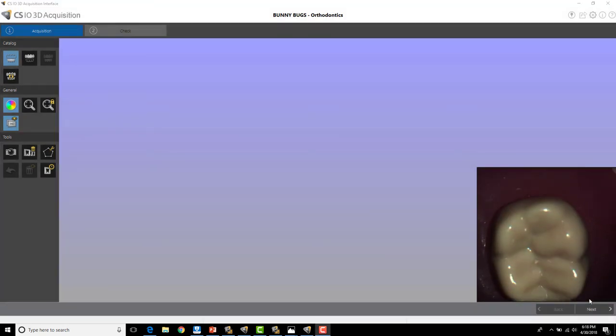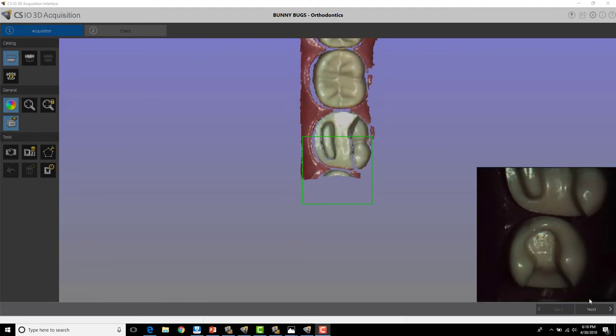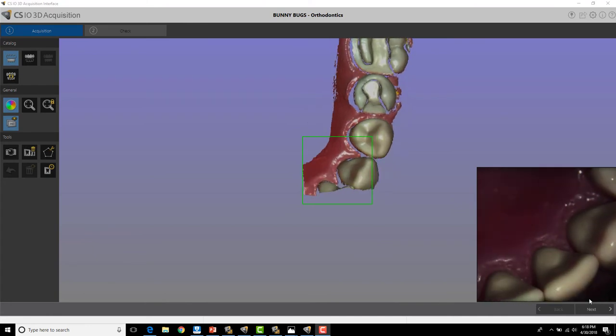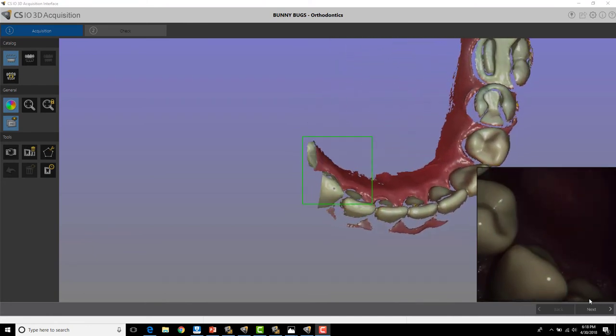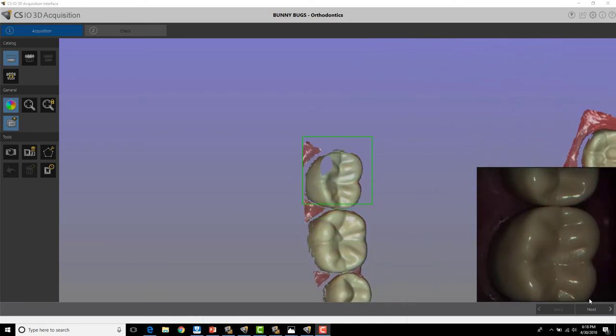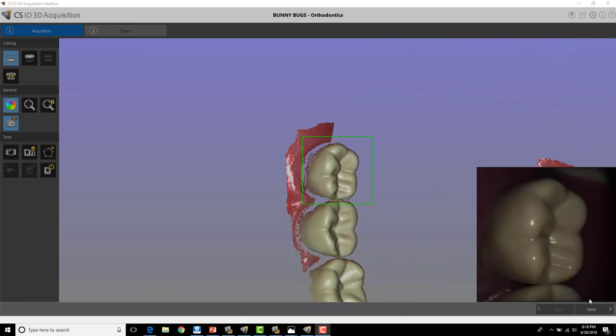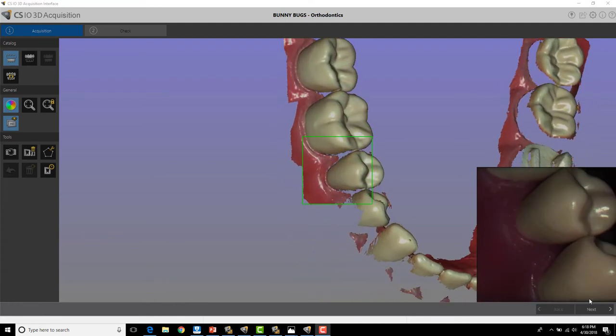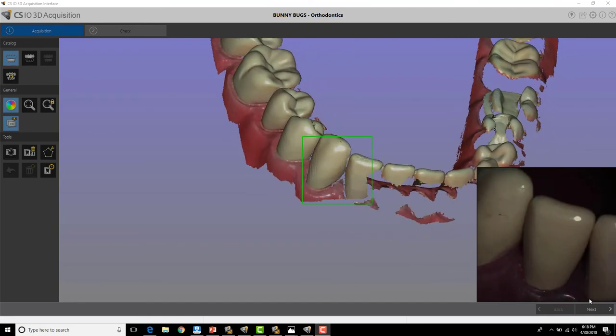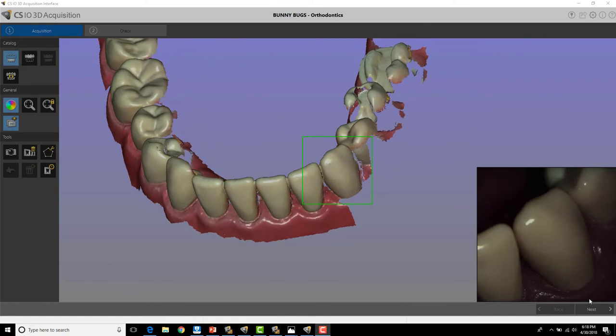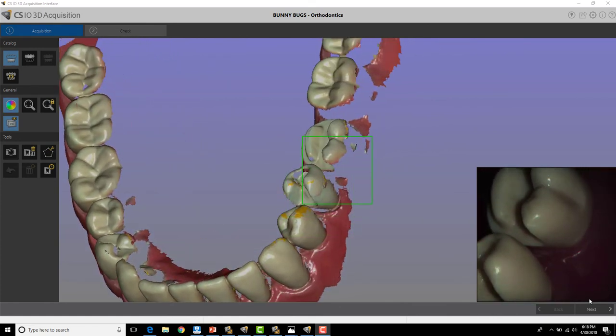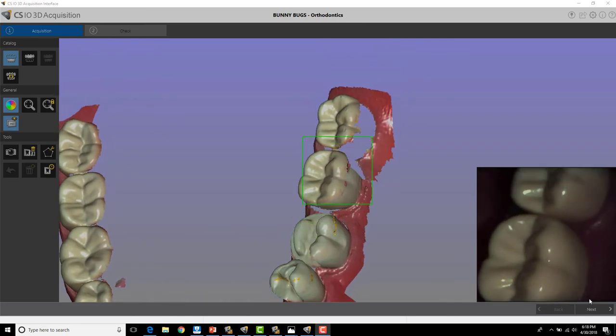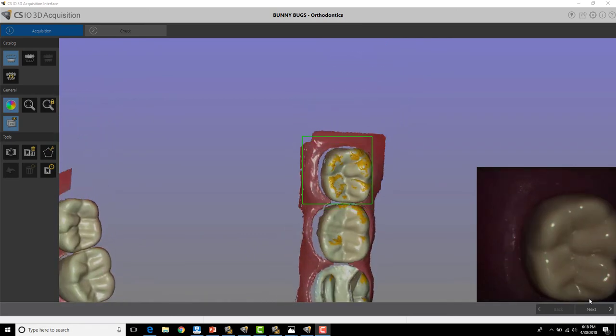So I'll start off in the posterior just like before, but this time when I get to the anterior, instead of going to a straight lingual shot, notice I'm going to go more of a straight down incisal edge first. That actually captures a little bit of the buckle aspect as well, which is going to help for when I come around to the buckle, a little bit more of a 45 degree angle instead of a straight 90 degree buckle. But notice how everything meshes together really nicely in the buckle aspect when I first scan that incisal edge. You'll also notice I'm not getting a ton of the green arrows by scanning it in this way.